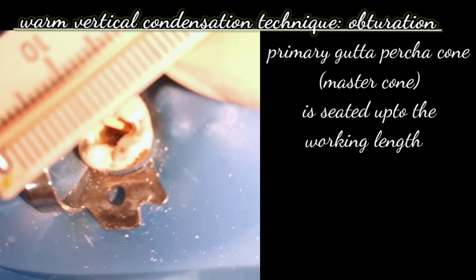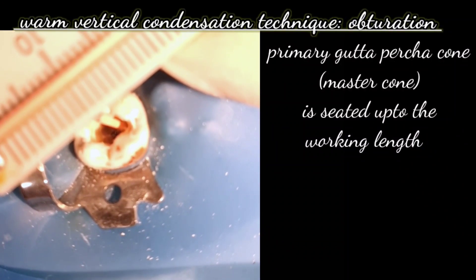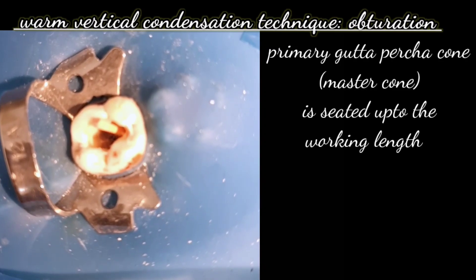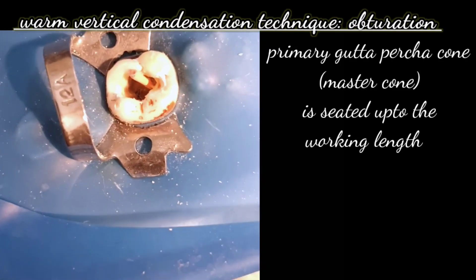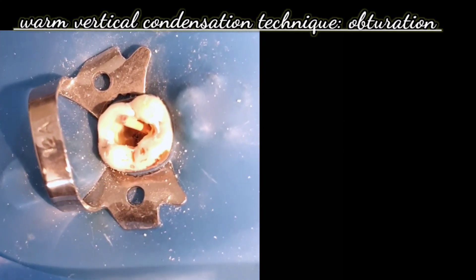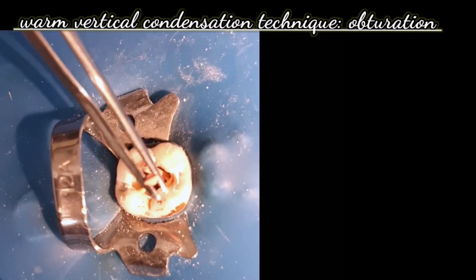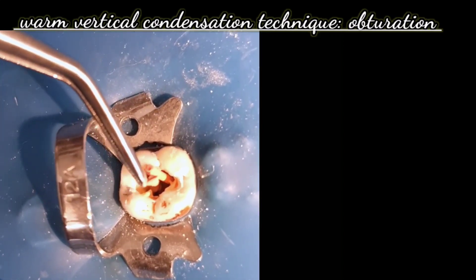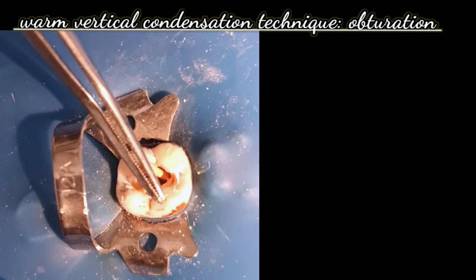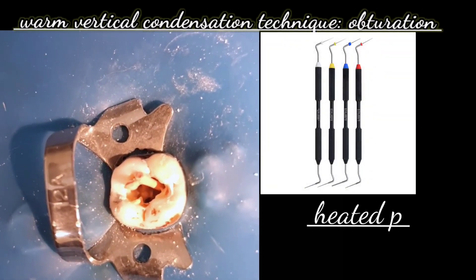For the other canal, we again take the primary gutta-percha cone — the master cone — and seat it up to the working length, coated with a thin layer of root canal sealer. That is how we fit this master cone or primary cone, seating it to the working length.